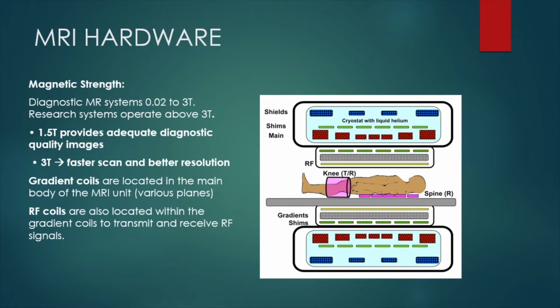Go to the MRI hardware. So as we could see, this is how the MRI system appears.